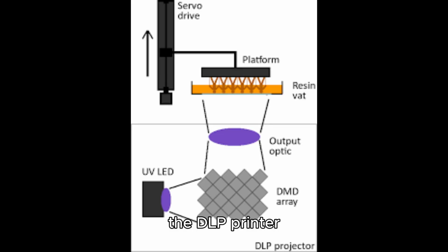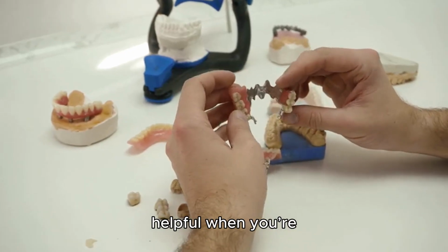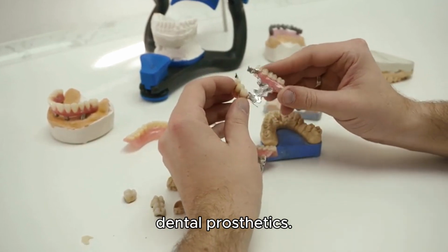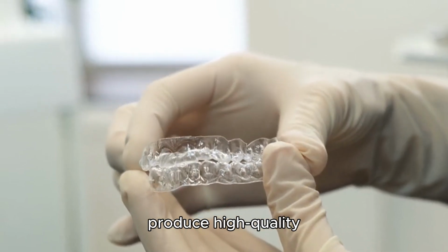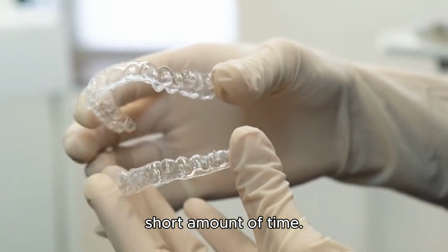As you can see, the DLP printer cures entire layers in one go. This feature is especially helpful when you're producing multiple items at once, like aligners or dental prosthetics. Many orthodontic practices rely on DLP printers to produce high-quality models and aligners in a short amount of time.